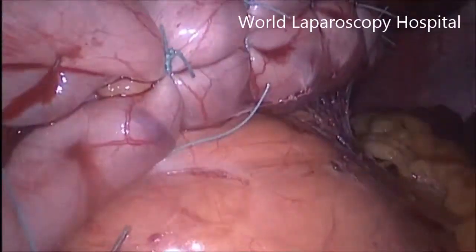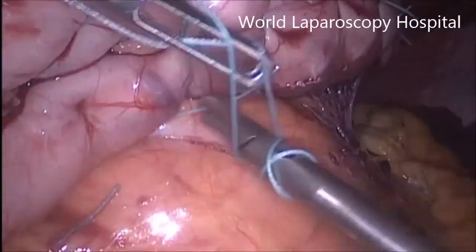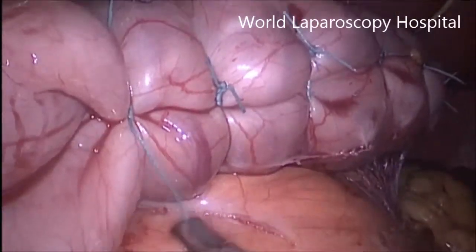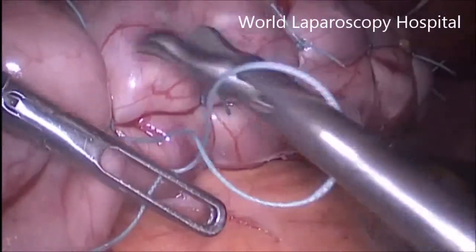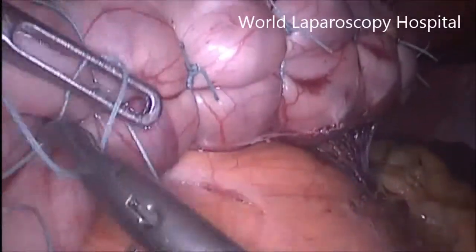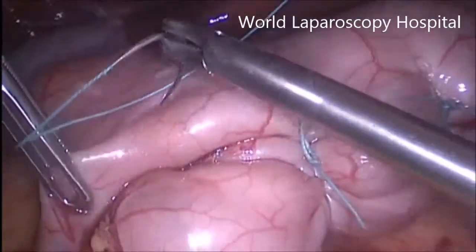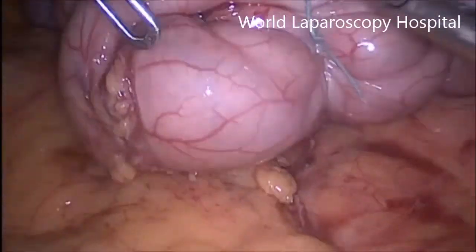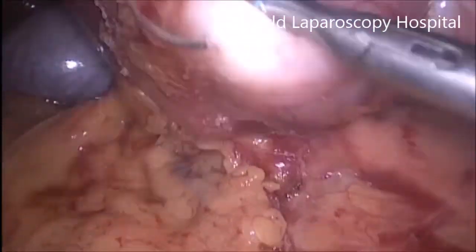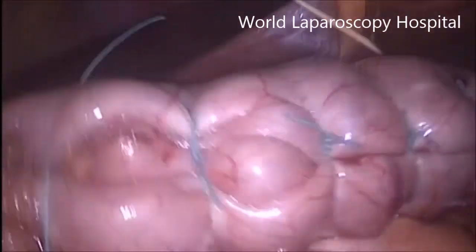One instrument will keep on pressing the greater curvature at the time of tightening so that it should be nicely plicated. When you reach near the pylorus, care should be taken that any herniation of the greater curvature should not be there and it should be tightly closed.